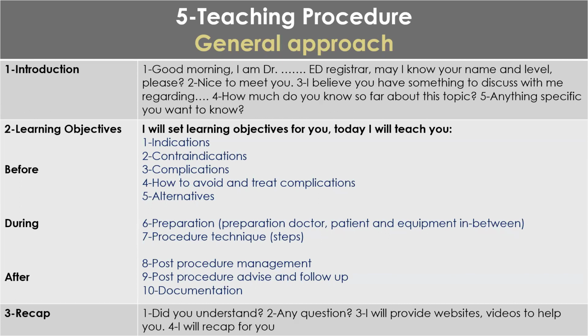Then when you've got patients that are in clot retention, sometimes they also need catheters to help you irrigate the bladder. And for contraindications, most times blood at the tip of the penis, especially with pelvic injuries, you don't want to pass catheters in such patients. Of course, patient refusal would be a contraindication to pass the urethral catheter. Am I clear up to this point?